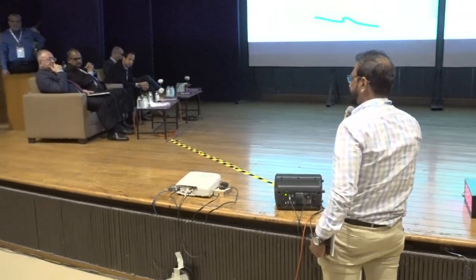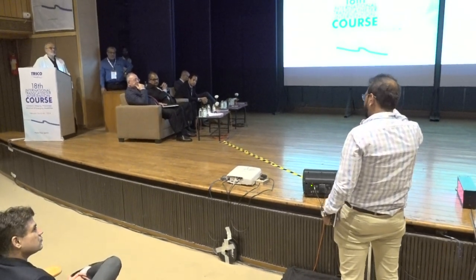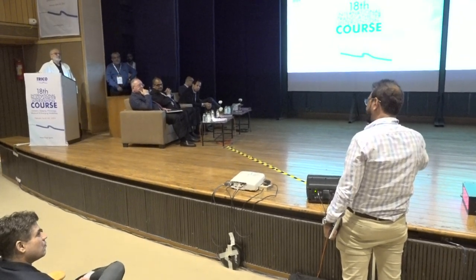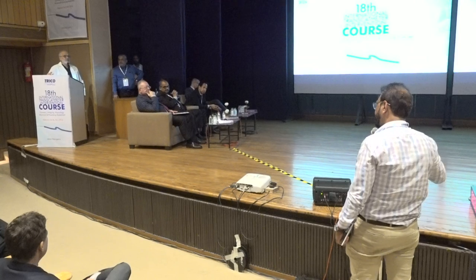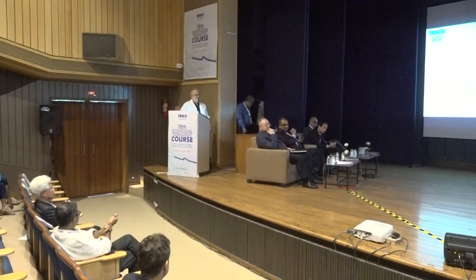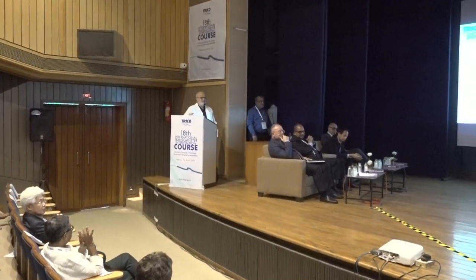So in the first case, there was a large nodule, which you did a rota also. And then still it was a persistent calcific nodule. See, rota burr, at that point of time I used, maybe was 1.5, but it had no effect on that calcific nodule. And when calcific nodule has differential calcium inside, rota will work very well. But if it is a robust calcific nodule with uniform calcium everywhere, it is a problem. I think Dr. Akasaka can answer this well.